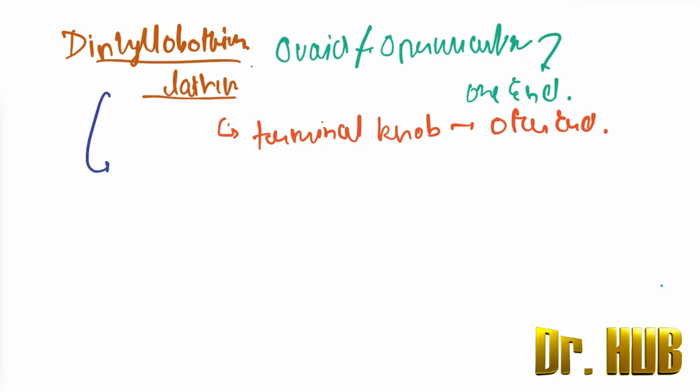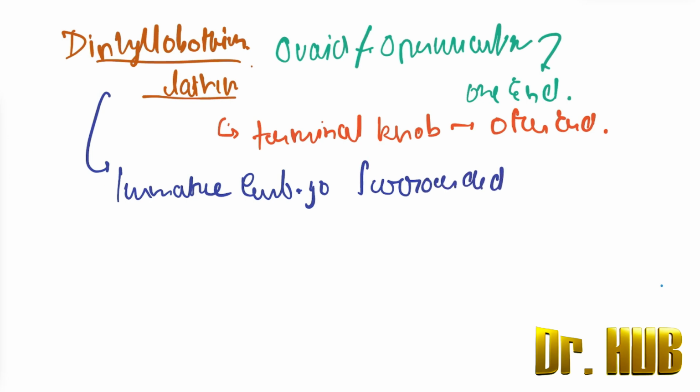What does it contain? It contains the immature embryo, and it is surrounded by yolk granules.